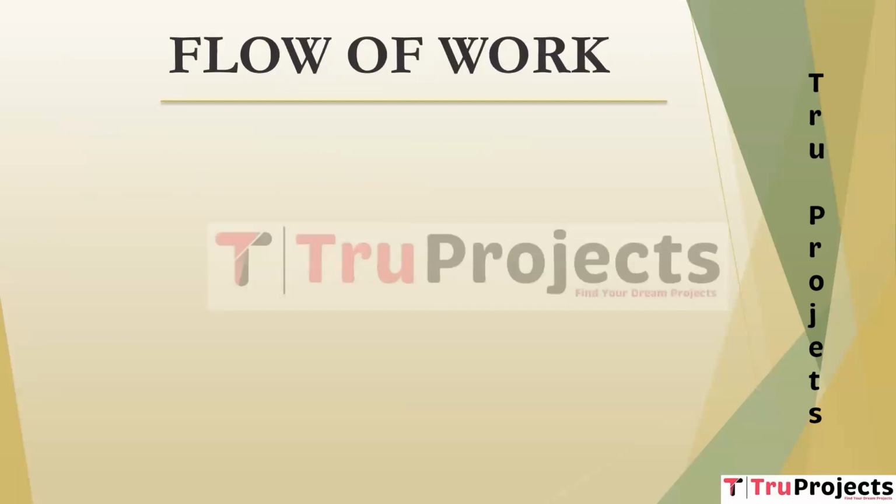In the flow of work, we have designed a few modules to execute the project. The first one is importing the packages. This module involves importing the necessary software libraries and packages, which are NumPy for data manipulation, Pandas also for data manipulation, sklearn for machine learning, Seaborn and Matplotlib for visualization, and TensorFlow for deep learning.